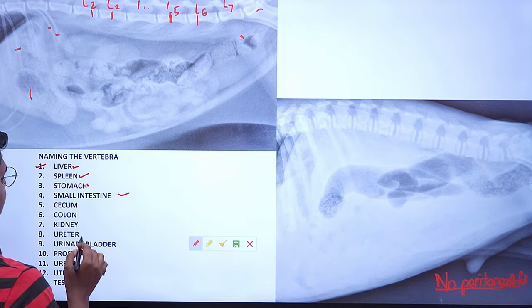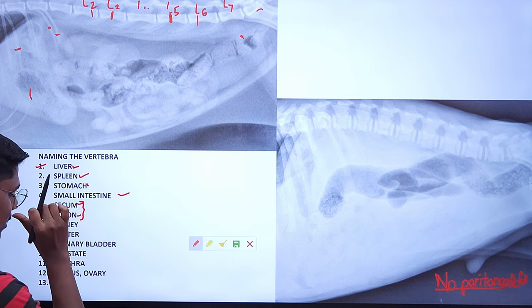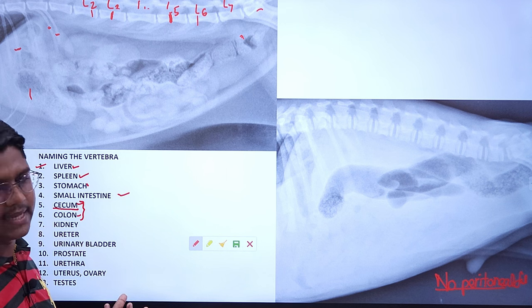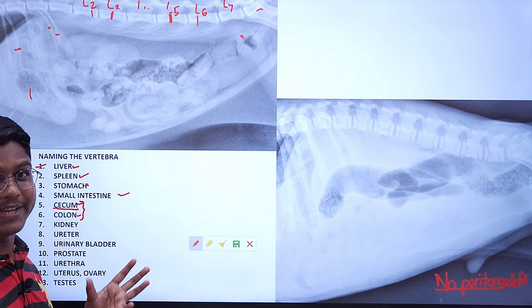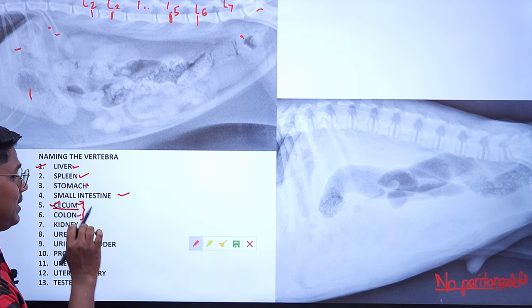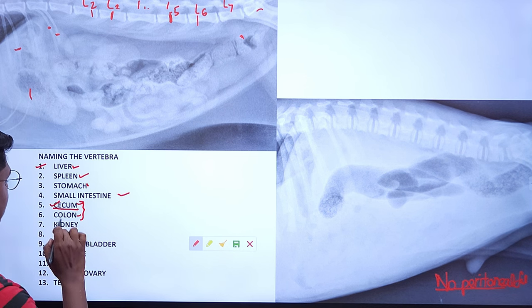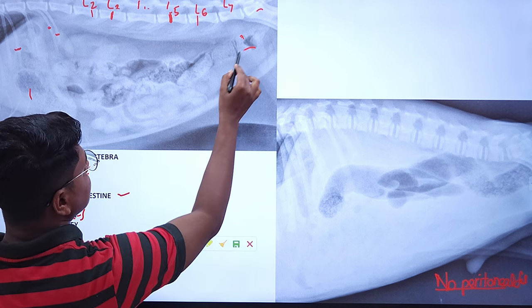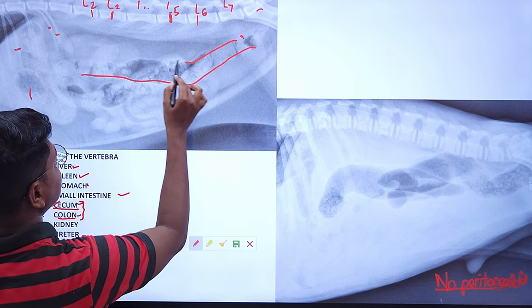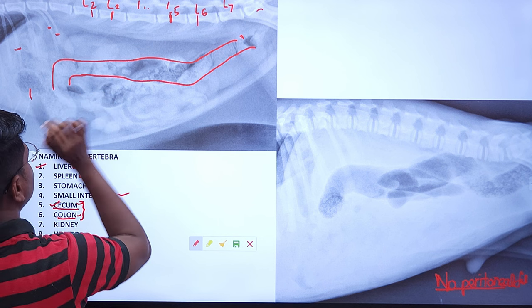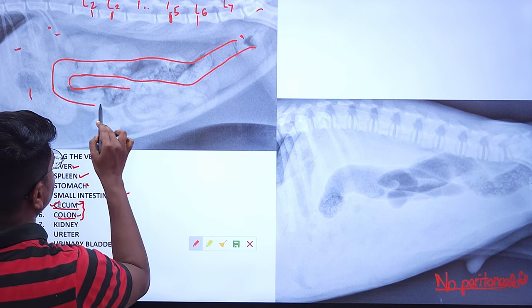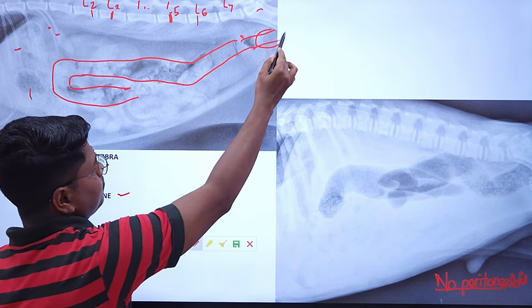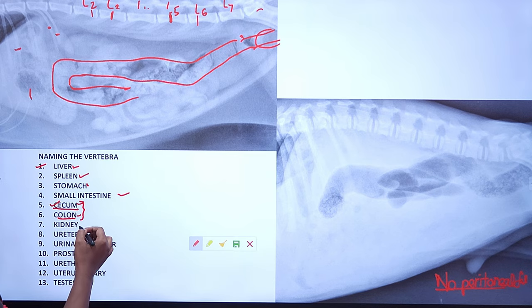The large intestine has two parts: cecum and colon (with rectum). The cecum is usually not visible in cats — it is conical, rarely contains gas, but is visible in dogs. The colon has three parts: ascending, transverse, and descending. In the lateral view, the descending colon is visible, followed by transverse and ascending.